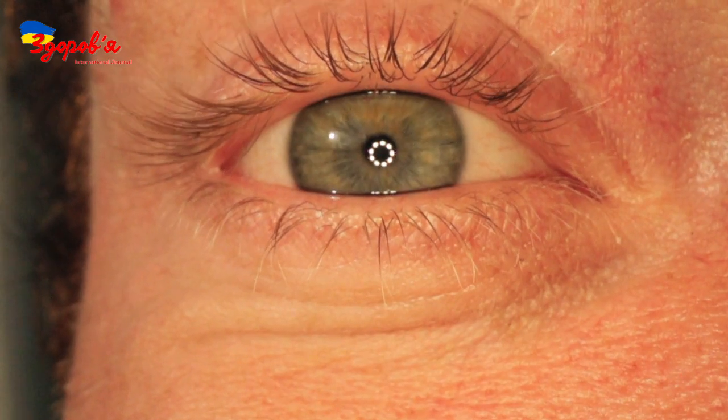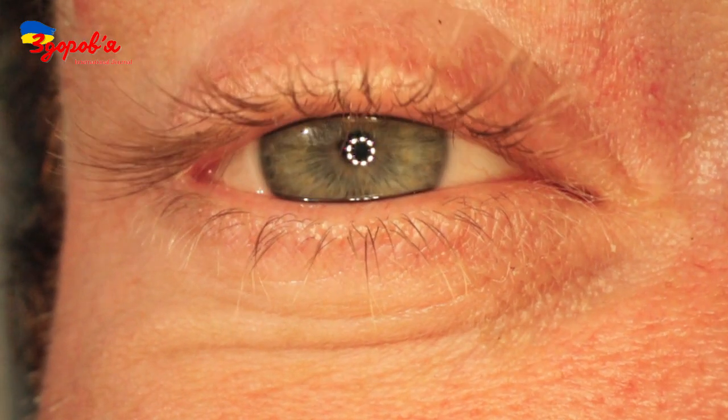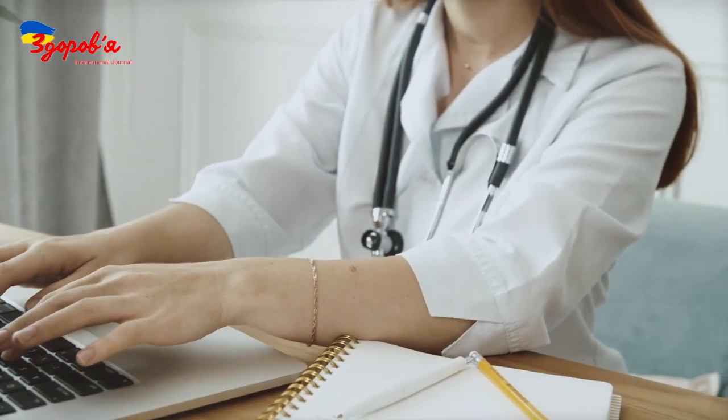Phacovitrectomy has several mandatory stages. Ultrasonic phacoemulsification. Complete or partial removal of the vitreous body. Intraocular lens implantation. After leaving the operating room, the patient receives the necessary recommendations for the recovery period: a schedule of visits and a list of medications to be taken to avoid complications.